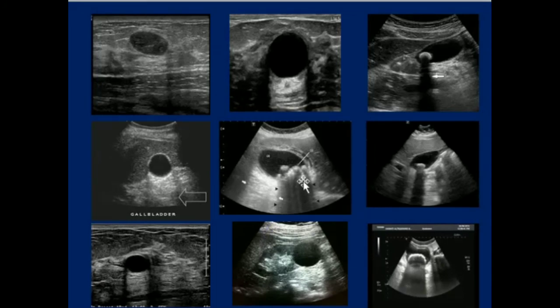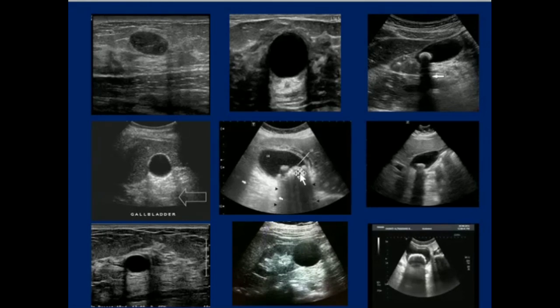This is a good image where we can appreciate both posterior shadowing and posterior enhancement. This is basically the gallbladder containing stones in its dependent portion. Acoustic shadowing occurs when the sound waves encounter a very dense structure and nearly all of the sound is reflected, resulting in acoustic shadowing. Thank you.